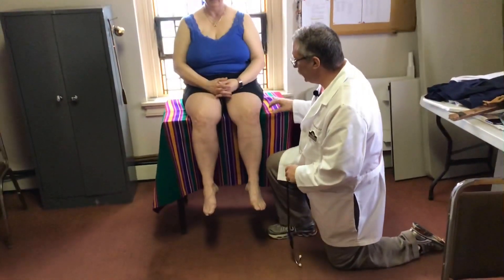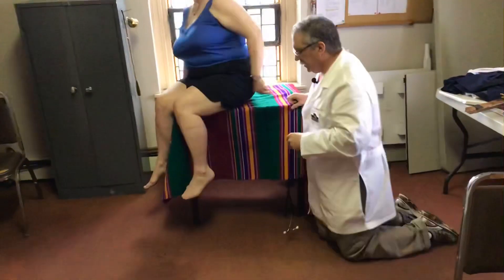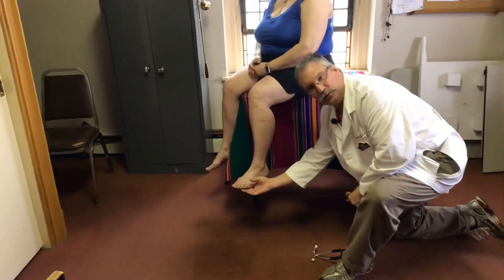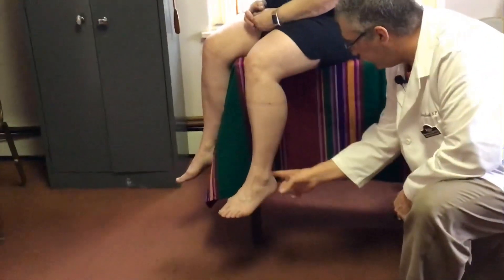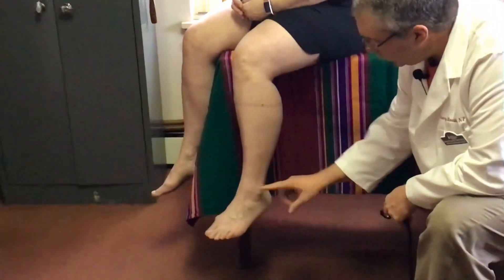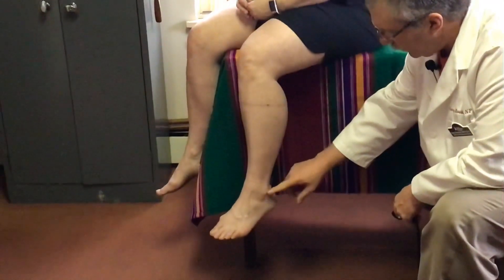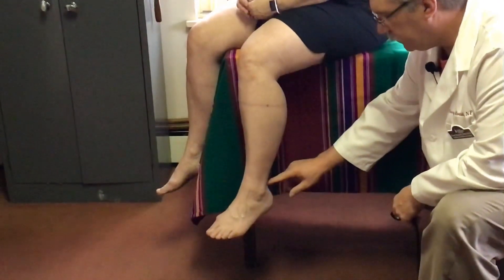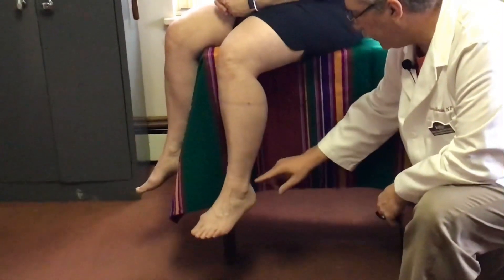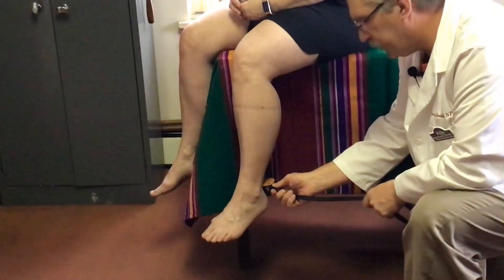If we have the patient turn just a little bit, I can show you where the landmark is. Support the front of the foot — here is where the Achilles is. Strike right in the middle, probably right around where the lateral malleolus is. You don't want to go too high, you don't want to go too low — kind of right in the middle is where you're going to strike.